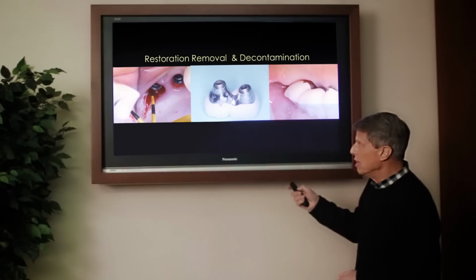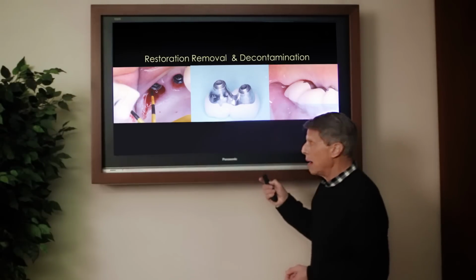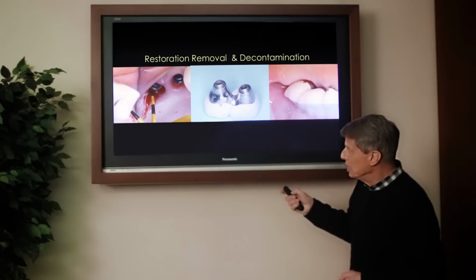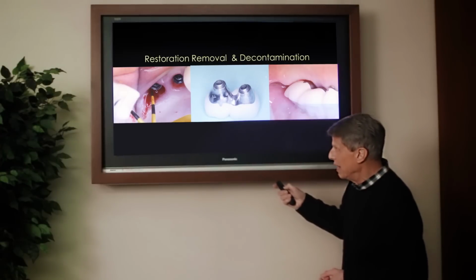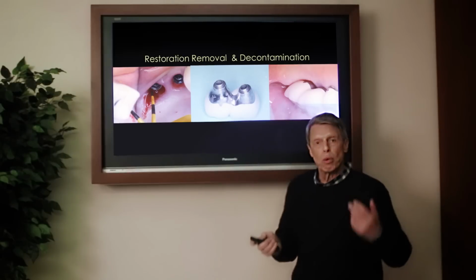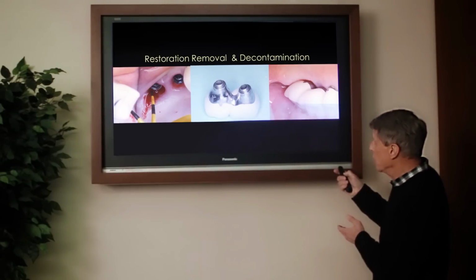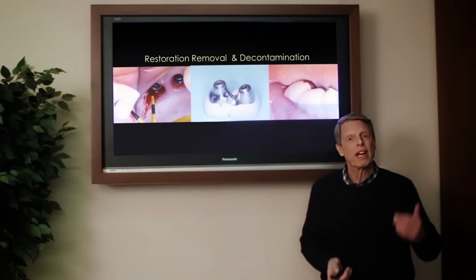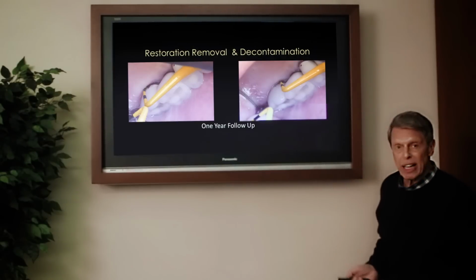You thoroughly clean the underside of the implant with the sodium hypochlorite, and now what we're using is an air polisher or whatever we can do to clean off any residual areas here, but we'll clean that very thoroughly. We then take the implant restoration, put it back in the patient's mouth, and apply pressure for a minute. And this is the 1-year follow-up.